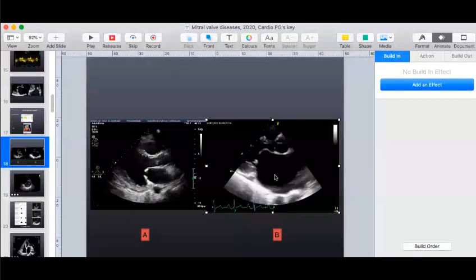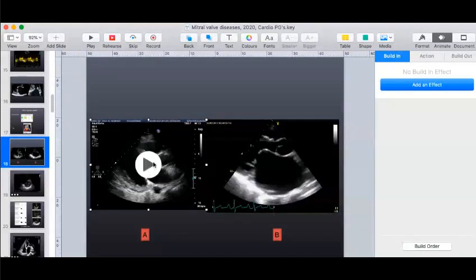So this is the one which has excessive mobility. So how would that translate into your auscultation? This excessive mobility, and what is that word which can be used for this? Opening snap. Opening snap. So this is a very pliable valve. Okay. It's a pliable valve, and it is related to your opening snap. Yes. So this other one does not have that excessive movement.